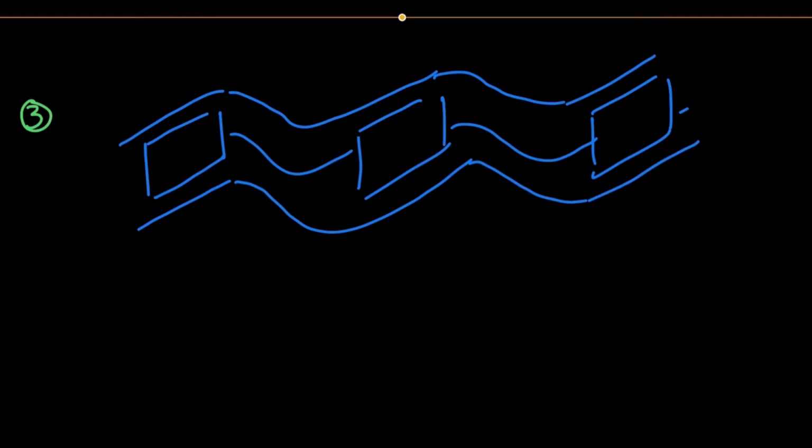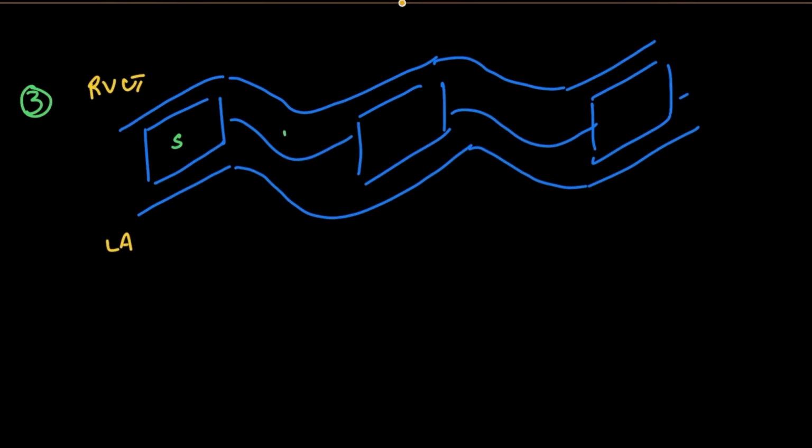And then technically up here, this would be your right ventricular outflow tract, and your left atria would be down here. We don't see the ventricles if you look at where we were slicing. And again, in systole, you see that the valve is open, so the blood can be ejected out of the left ventricle. During diastole, the valve is closed. Systole, open. Diastole, closed.